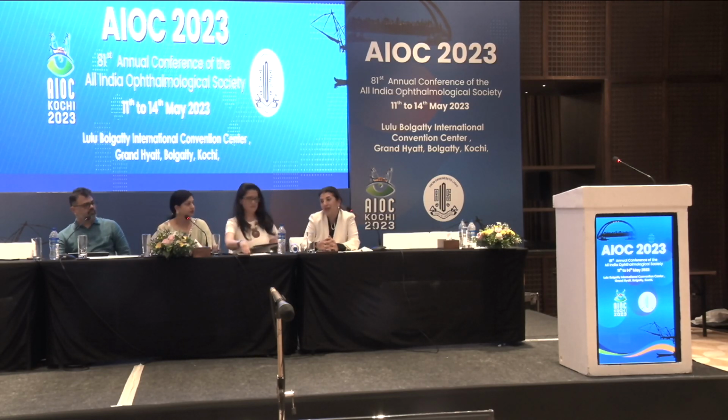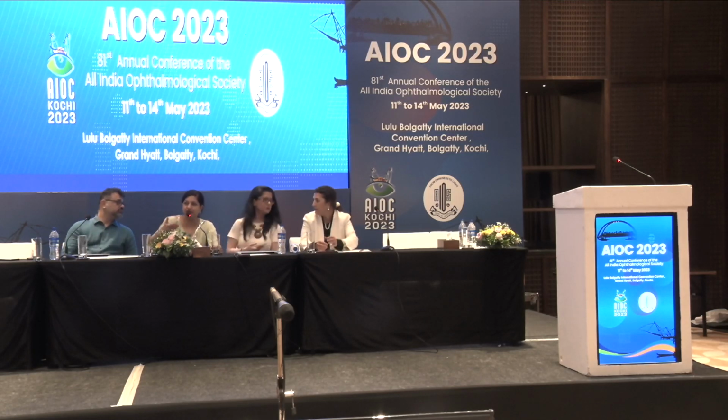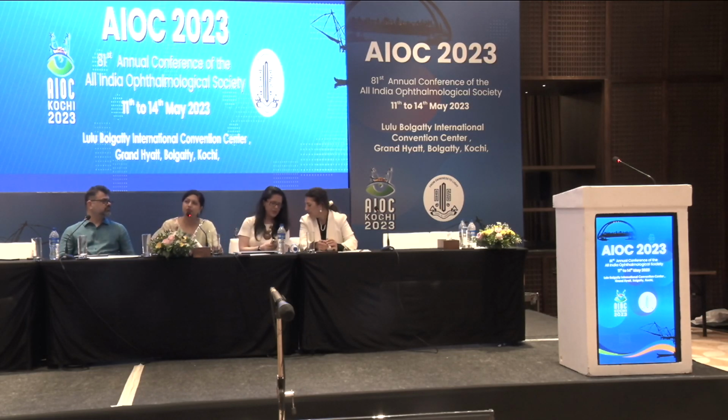But if the patient has had a previous refractive surgery, or if you're choosing a patient of an RK, which normally you would not put such lenses in, those are the rarer cases where you would have a refractive surprise. So if it's your own patient and you have picked it up early, say in the first week or the first 2 weeks, and you found out that it's a refractive surprise, if it's up to 1.5, you can probably wait and then do a laser touch-up.